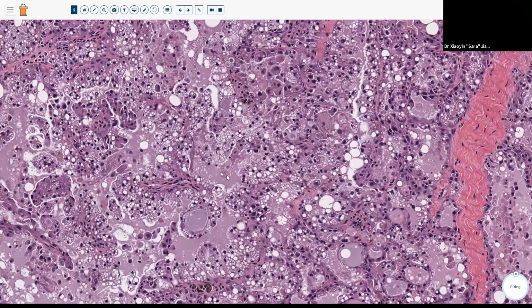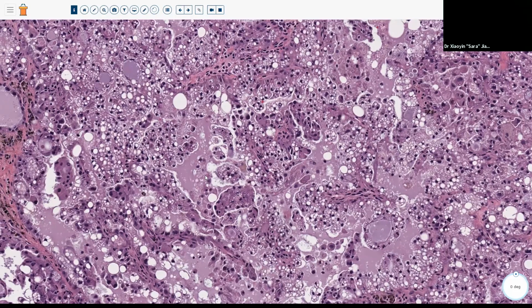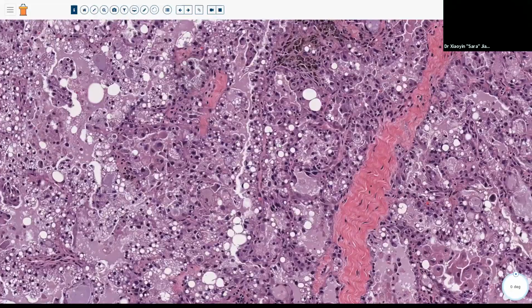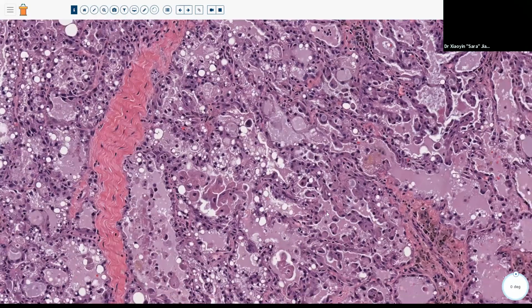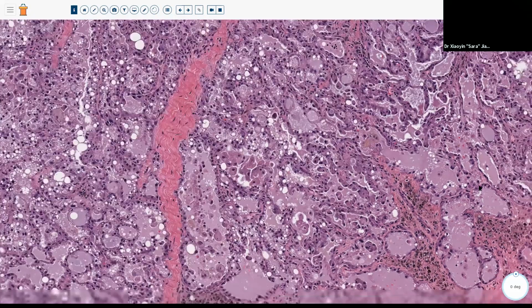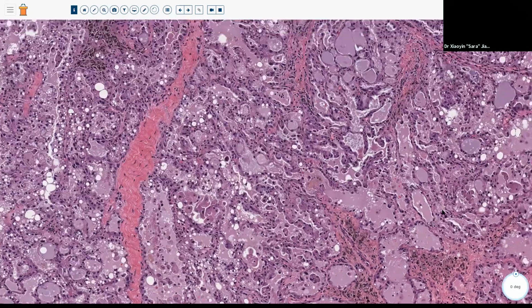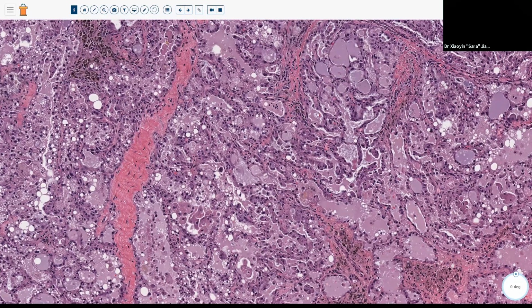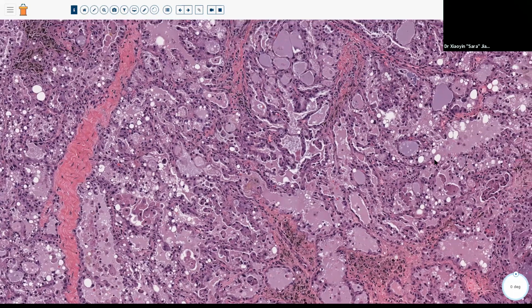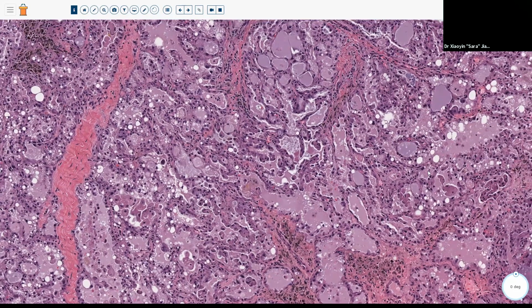So we have some cystic areas, and we have a lot of bubbliness going on. So kind of bubbly cells, cystic areas, maybe some areas where you go over to almost kind of an apocrine or secretory look to a lot of these cells. And so if you think about this tumor, this was initially called mammary analog secretory carcinoma. Now it's called secretory carcinoma. And it looks like, if you were looking at breast, a secretory carcinoma of the breast. I mean, if you think about it, the breast is just a modified salivary gland, right?